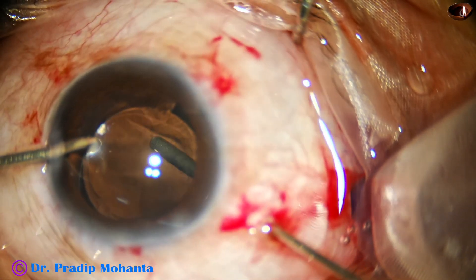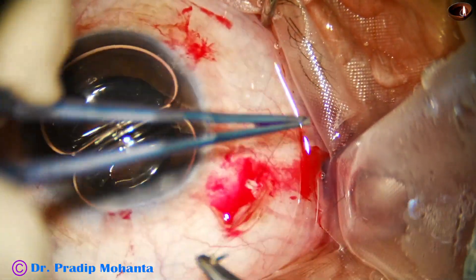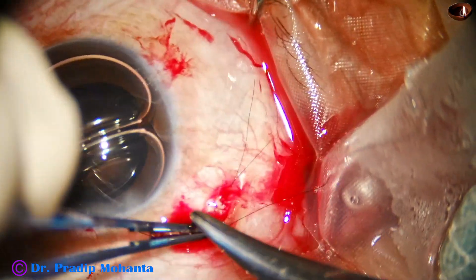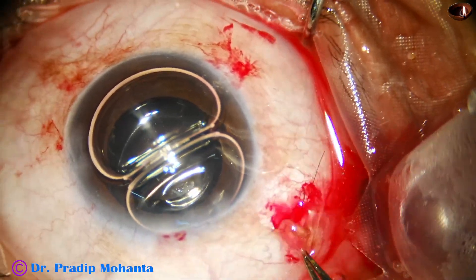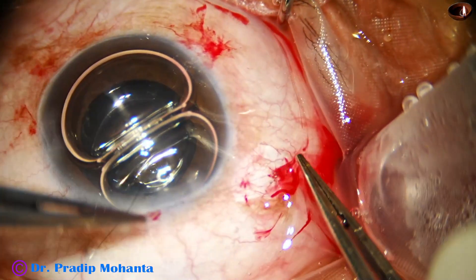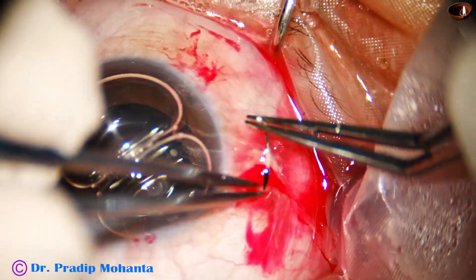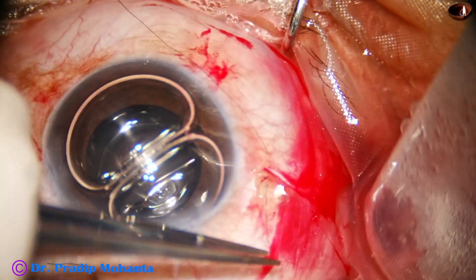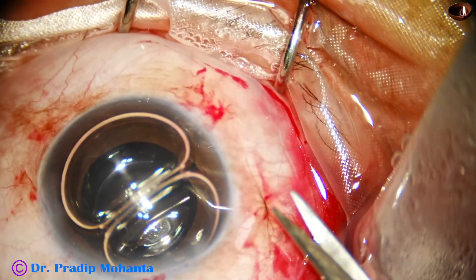A nice anterior vitrectomy is done. After doing anterior vitrectomy, we have to close the sclerotomy. I am using a 10-0 nylon suture — you can use 8-0 vicryl or 7-0 vicryl, whatever you want. I prefer 10-0 nylon because it causes less irritation to the sclera, and for such a small sclerotomy wound we can easily close with 10-0 or 9-0 nylon. I am using a releasable suture to close the conjunctival wound — just make three loops, pull and cut, and your releasable wound is made.